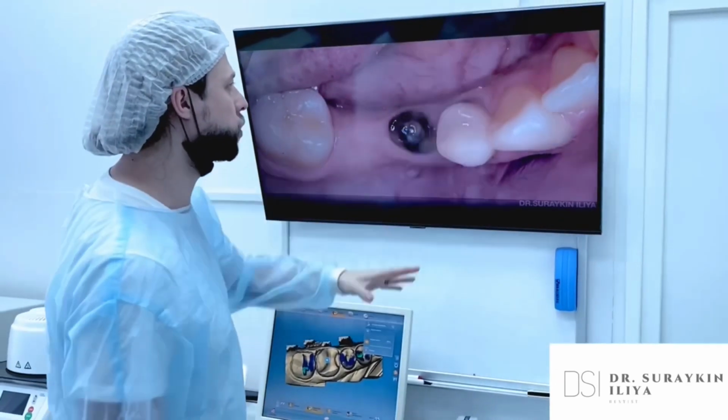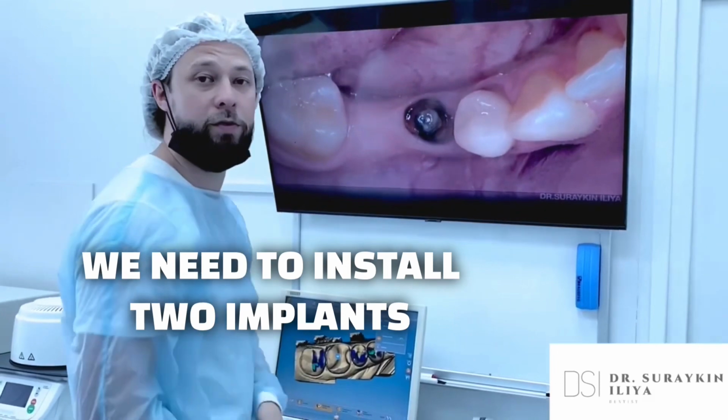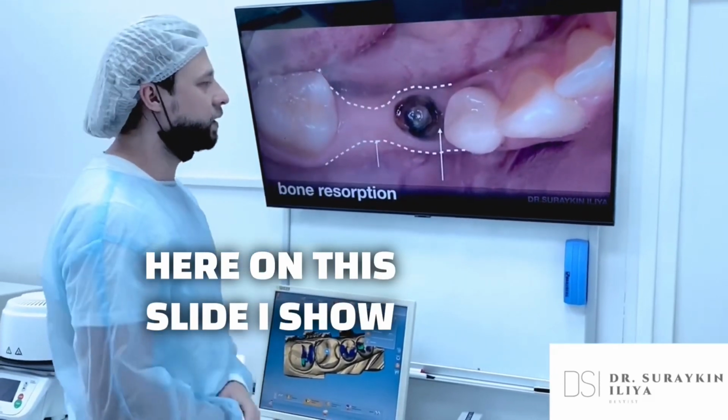The adjacent teeth are in good condition. We treated them and everything is fine with them. Our work area is this part. We need to install 2 implants here. What we will do. Here on this slide, I show the resorption of bone tissue.